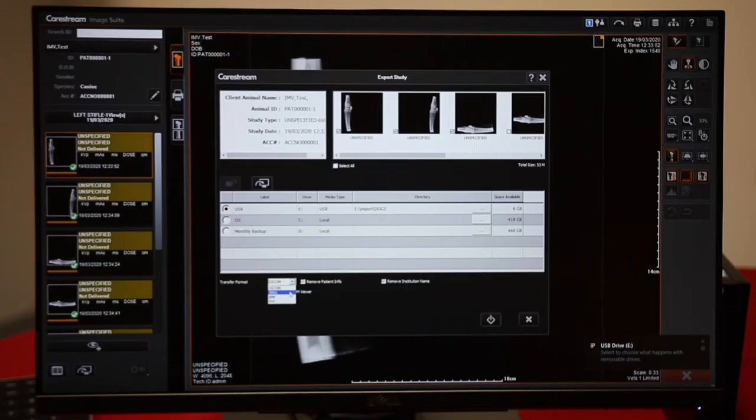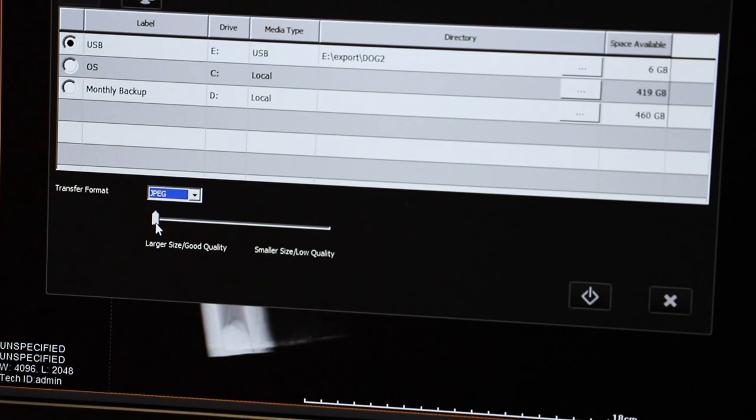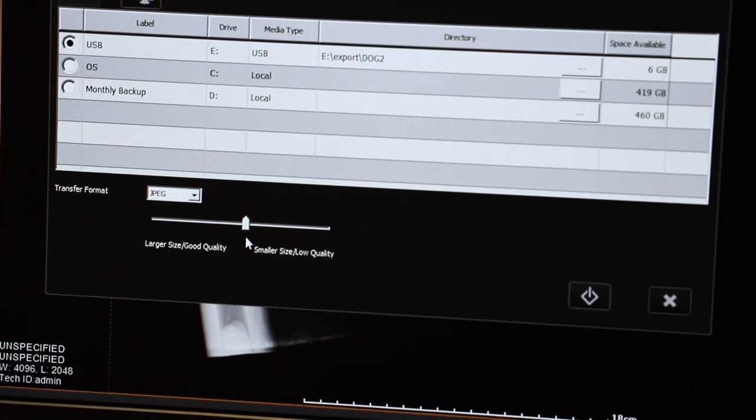If you would like to send a JPEG, a compressed file, then you can choose which size and quality you want to send. I'm going to go somewhere in the middle.